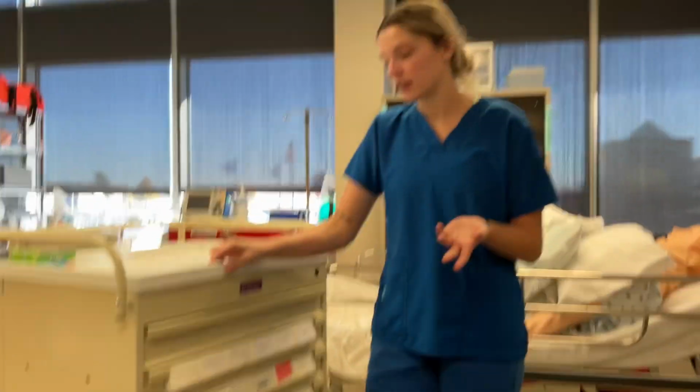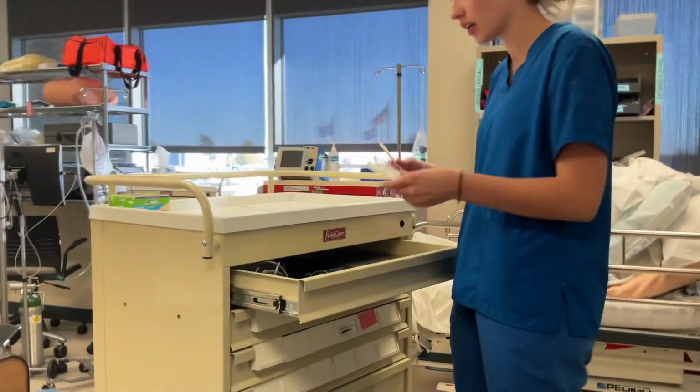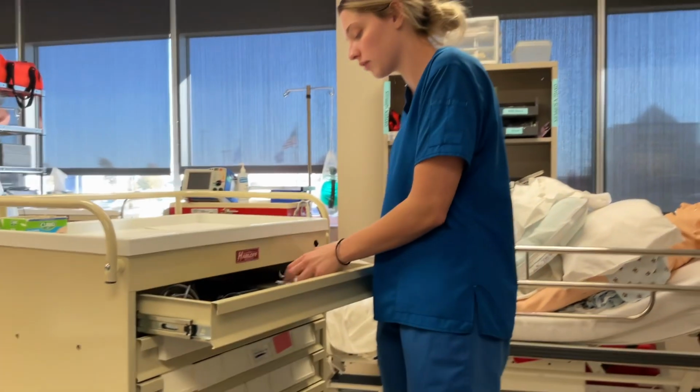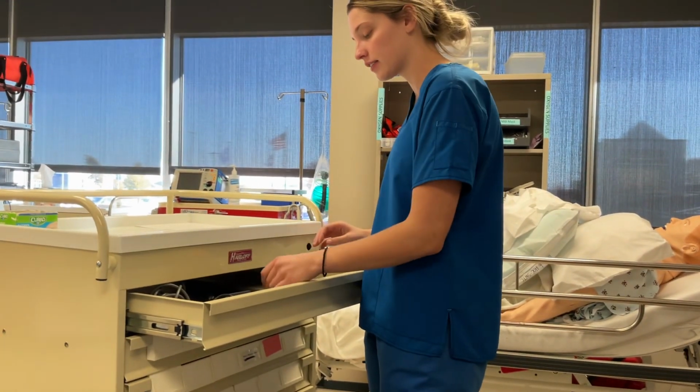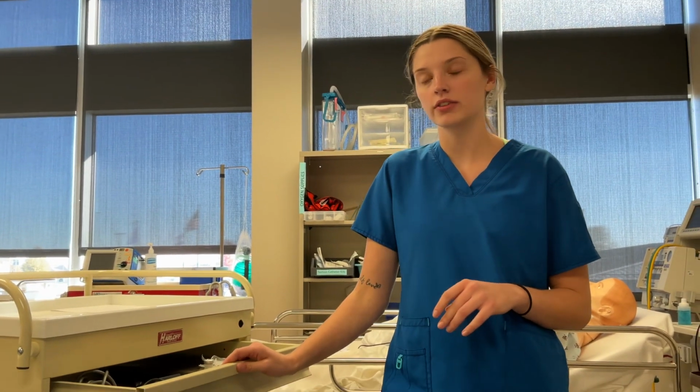I would gather my necessary equipment that I need, which I have all on the table. I would check the integrity of everything I'm using today. It would be closed today. It's open for practicing purposes. Integrity's good. Today I'm using a 22 gauge 1.5 inch for the needle.